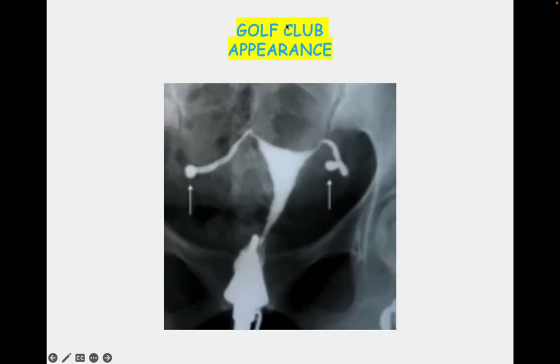Another finding is the golf club appearance, which is again because of fixed tubes. The tubes are fixed and blocked, with the ampulla getting dilated, giving the typical golf club appearance.